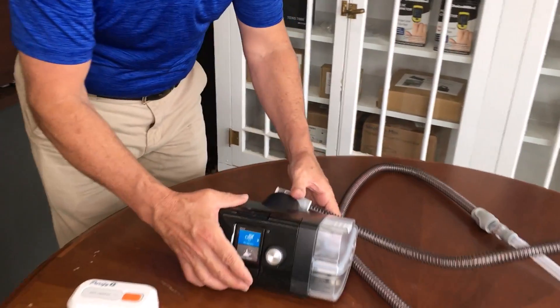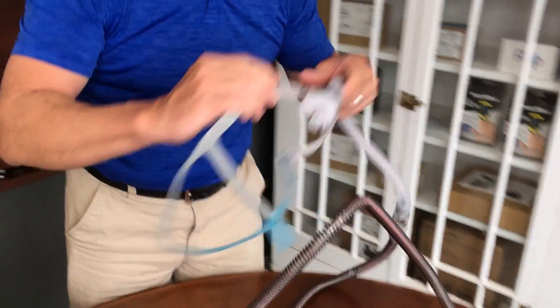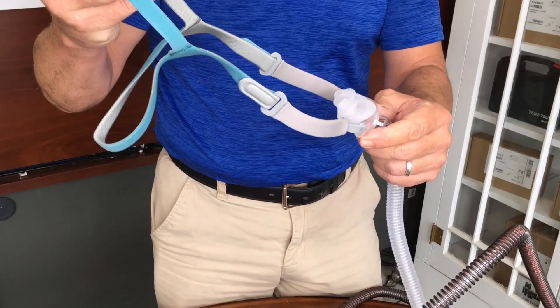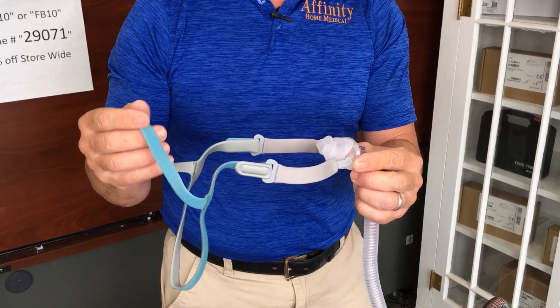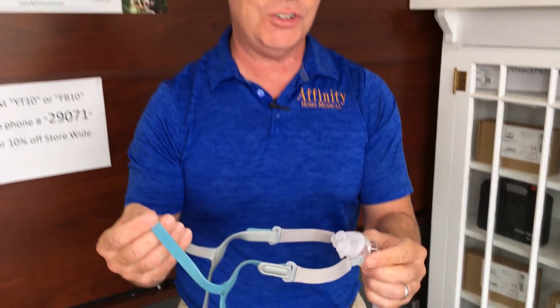If you can get a close-up here of the AirSense 10 — this is what you're probably super familiar with. This particular interface is the Rio nasal interface and it's a really good one, it's inexpensive. But this is just an example. You may use a nasal mask or a mask over your nose and mouth. Anything you're using is going to operate in the same way I'm about to show you.